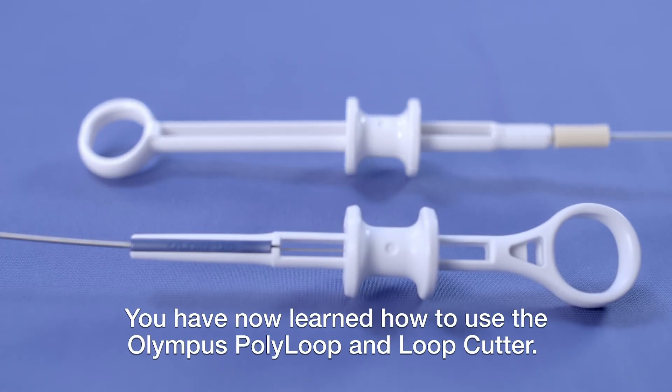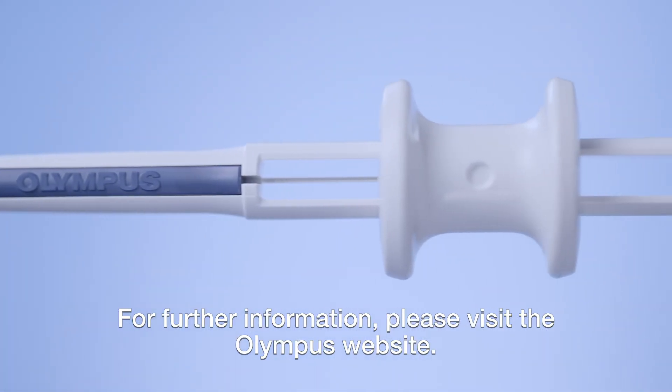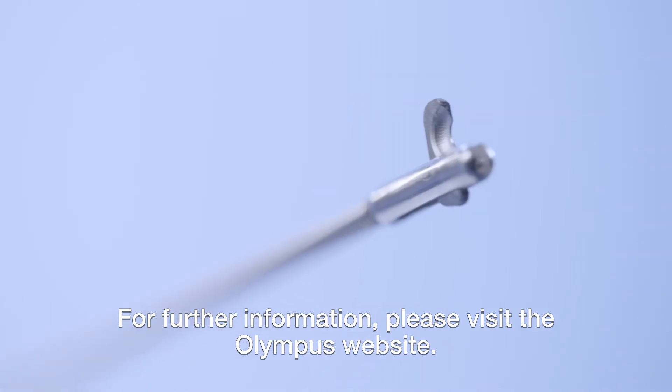You have now learned how to use the Olympus Polyloop and Loop Cutter. For further information, please visit the Olympus website.